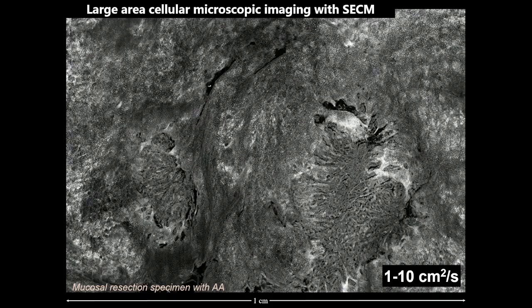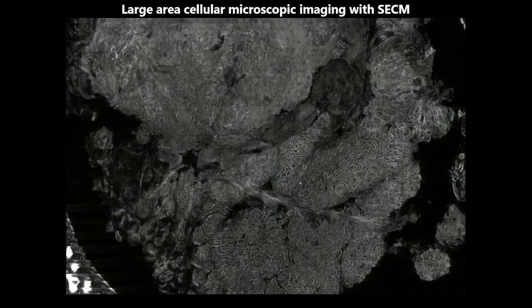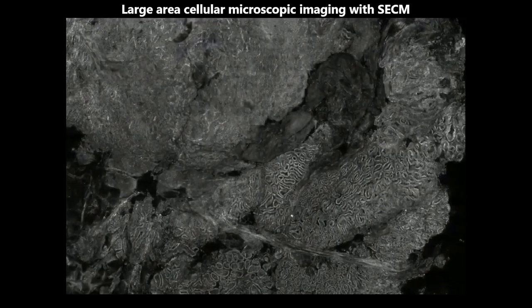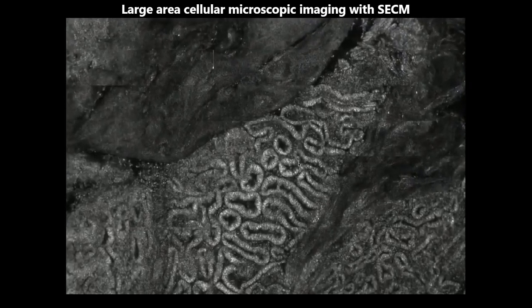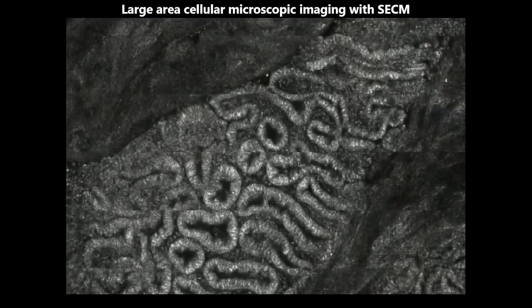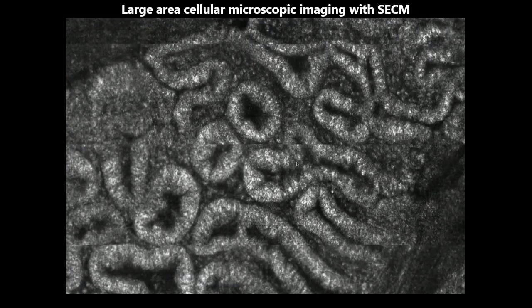So this is an example of a reflectance confocal microscopy image of Barrett's. And you can see these little white dots here in the upper right-hand corner. Those are nuclei of individual squamous cells. And this is a high-grade dysplasia actually infiltrating into the squamous mucosa. The neat thing is you can look at low power and see the architecture, and then you can zoom in at high power and look at individual cells. And I think somebody in the audience here was part of coining this Google Earth body. So you can start at low power, and then you can zoom in down to high power.